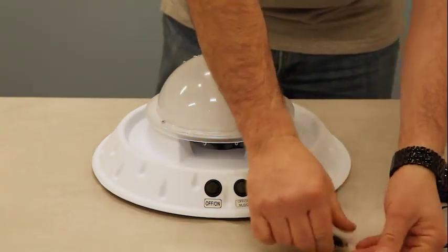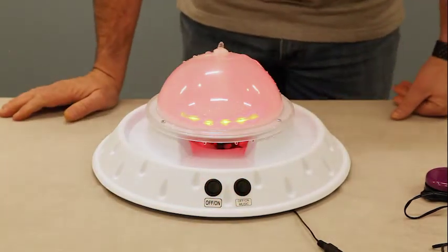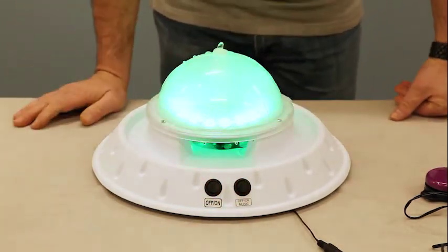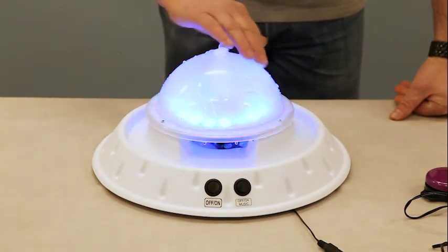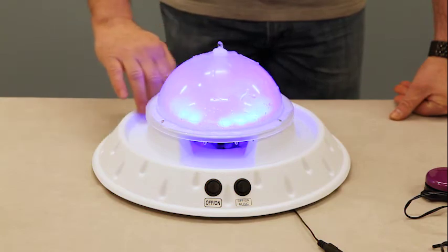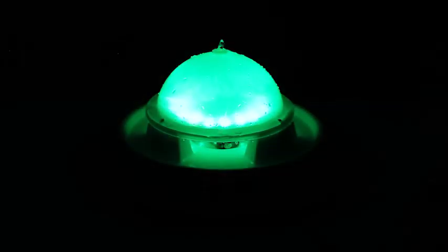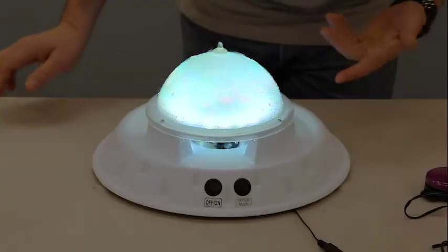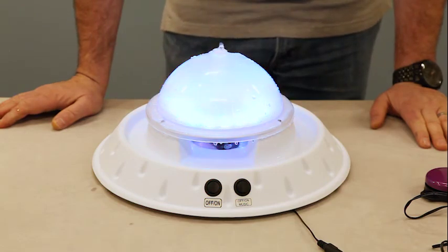Now you can have it on auto so somebody can just watch it if they'd like. They can touch the top — the water comes down from the top very slowly — and they can put their hands in the trough.